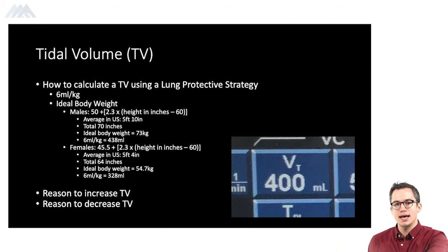Every time that we exhale, we're exhaling more CO2. So the larger volume you inhale, the larger volume you exhale, and that is going to drop your CO2. If maybe that initial setting is dropping your CO2 too much and now we need to increase that number, we're just going to decrease the volume that we're putting into the lungs. So if our CO2 is too low, we can decrease our tidal volume. That then will be a smaller breath that we're taking and a smaller breath that we're exhaling. If we're exhaling less CO2, then that means that we'll have more CO2 within our body.